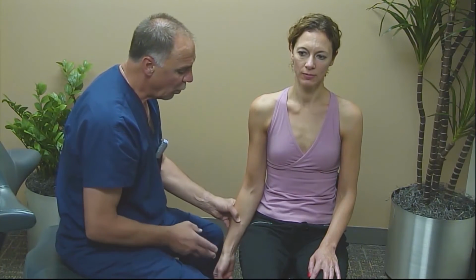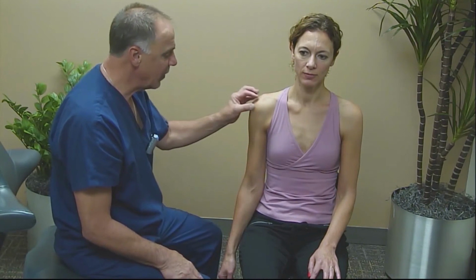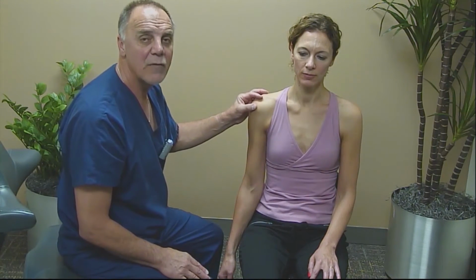Now, once we've accomplished all of our anterior superior anatomy, the next structure that we're going to look at is the all-important supraspinatus tendon. In the neutral position with the arm lying along the side like this, we see about 1 centimeter to 1.5 centimeters of the supraspinatus tendon uncovered from underneath the acromion. But we want to get better exposure, so we're going to ask the patient to do a couple of maneuvers to help bring the supraspinatus tendon from underneath the acromion, so that we get a better view of a longer length of the supraspinatus tendon.